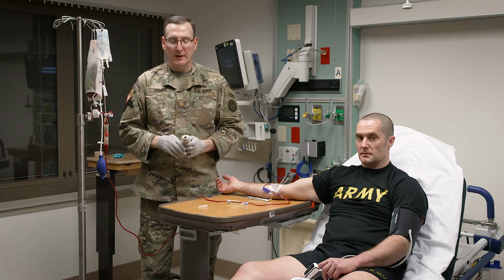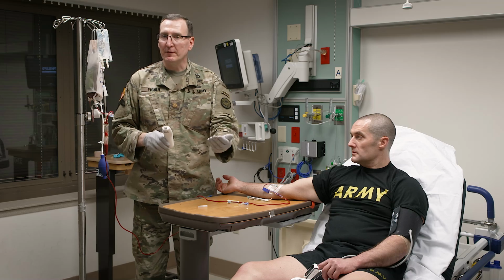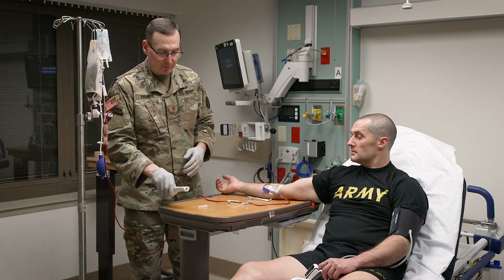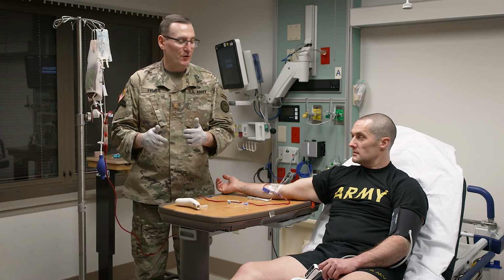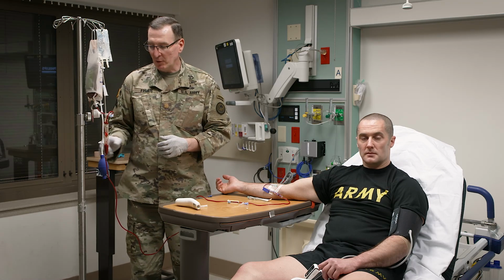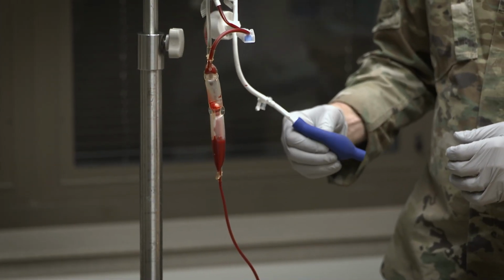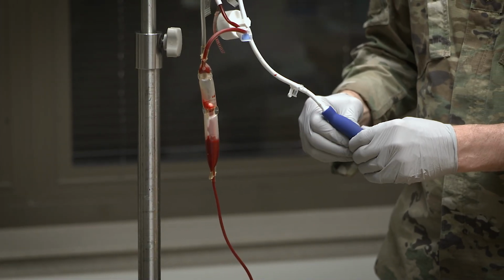Once that's done, if it's all normal, given that a patient may be in hemorrhagic shock, but I don't see any increased temperature of concern, and I don't see any sort of signs or symptoms of a transfusion reaction, I can go ahead now and pump up my pressure infuser to give blood at a more rapid pace.